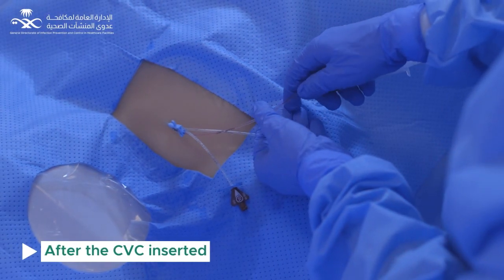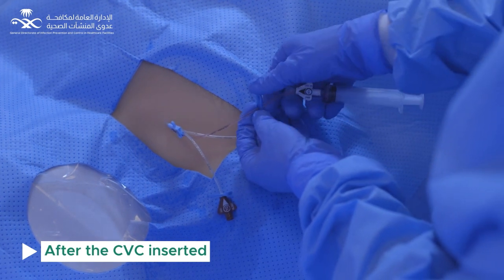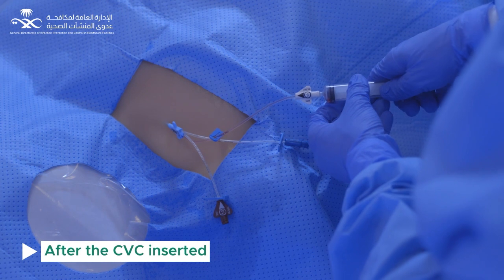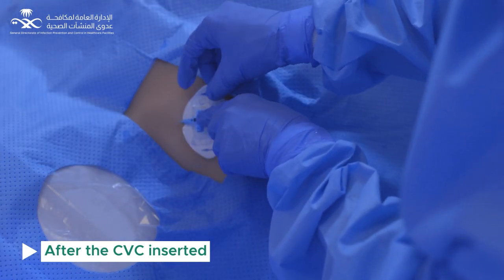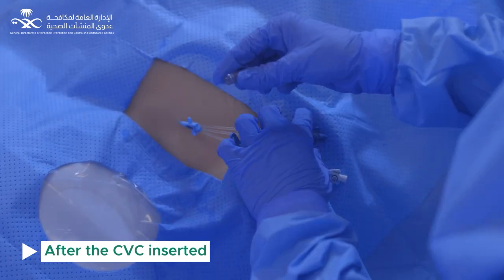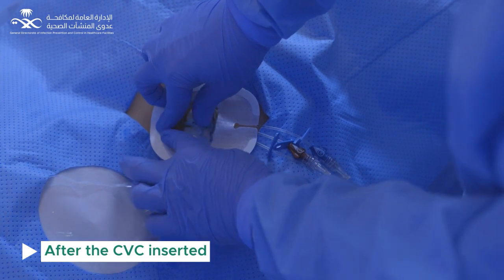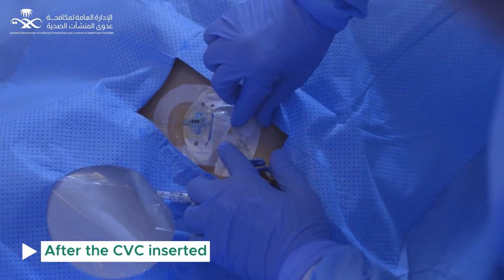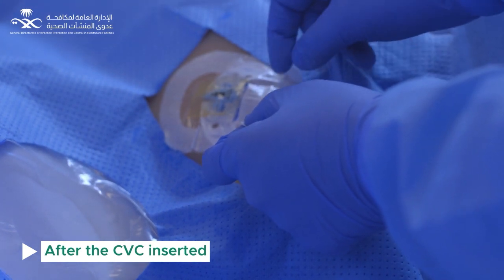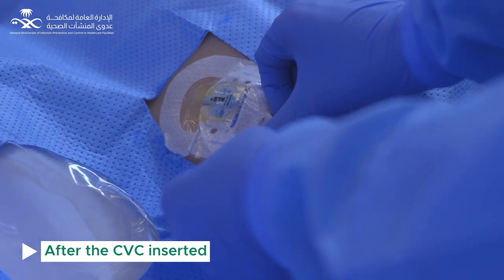Once the central line is inserted and in place, aspirate and flush all lumens, then reclamp and apply disinfected lumen caps. Apply the stabilization device. Use chlorhexidine impregnated dressings and put needleless connectors on all open connections. Cover needleless connectors with disinfecting antimicrobial caps. Apply the information label over the dressing. After doffing personal protection equipment, make sure all contaminated items are discarded as per Ministry of Health policy.